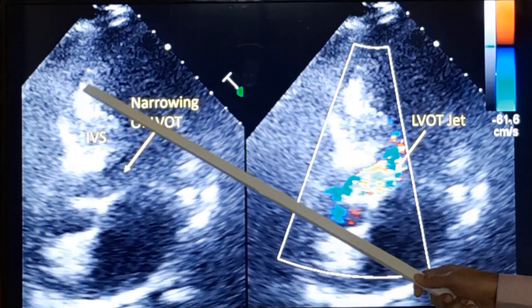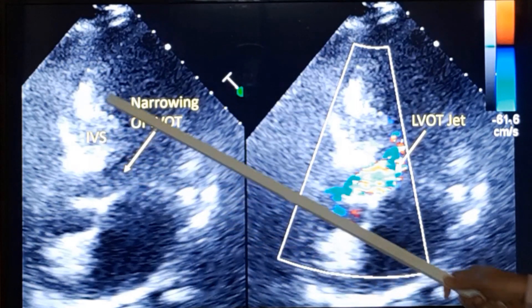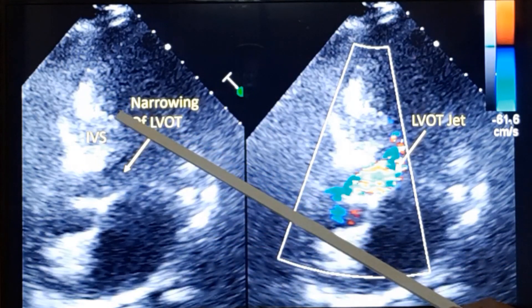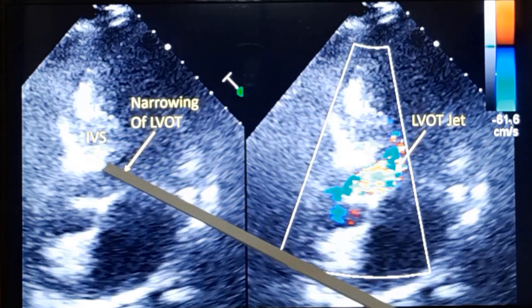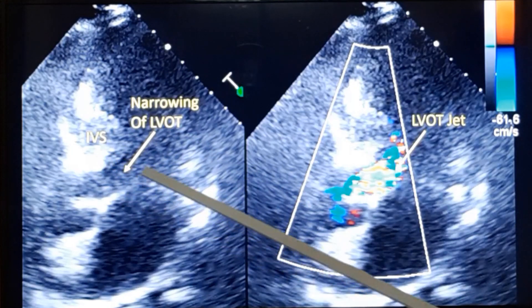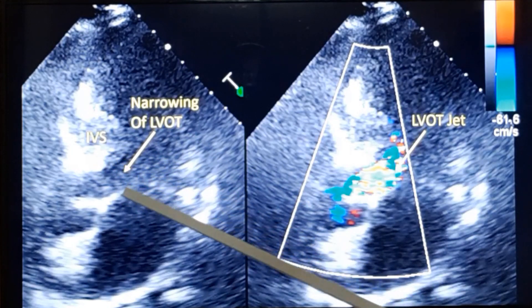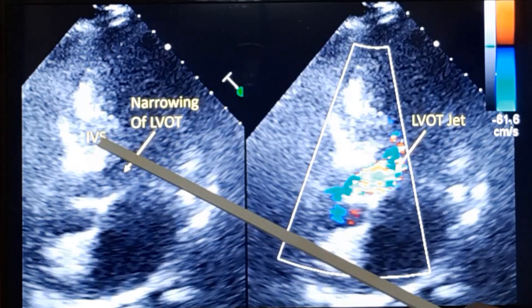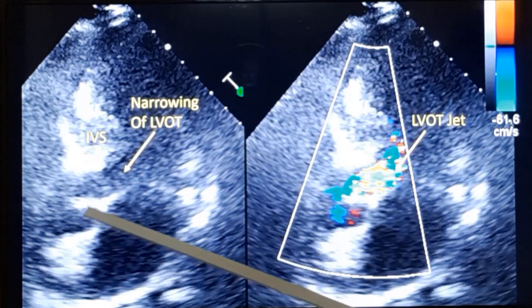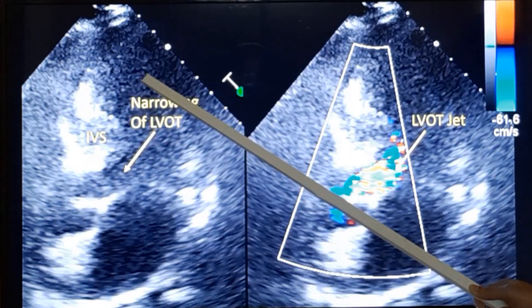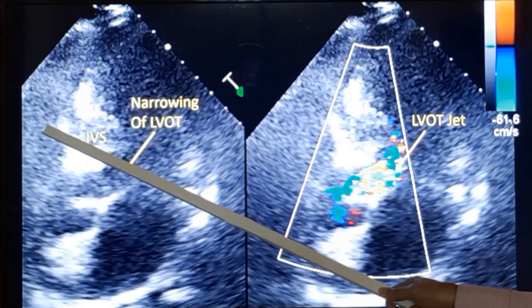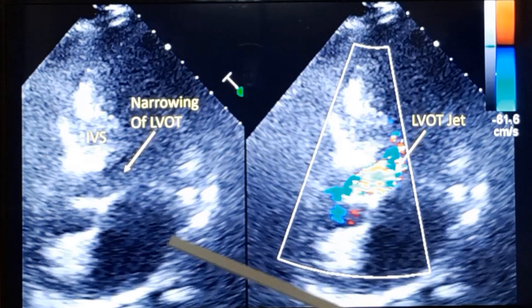You can see the grossly thickened interventricular septum which is bulging into the left ventricular outflow tract. This is the anterior mitral leaflet. This is the interventricular septum. This is the aorta. This is the left ventricular cavity, right ventricular cavity, and left atrium.